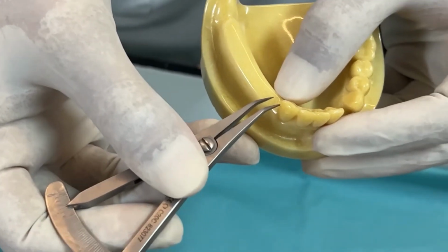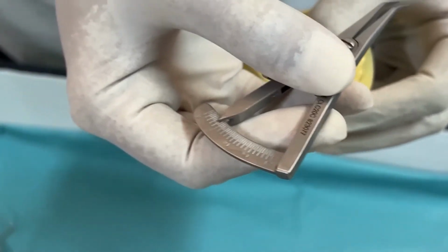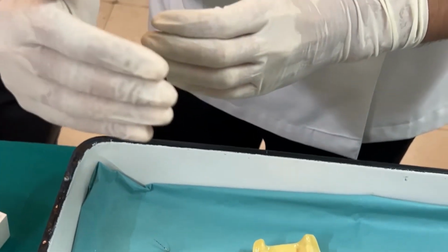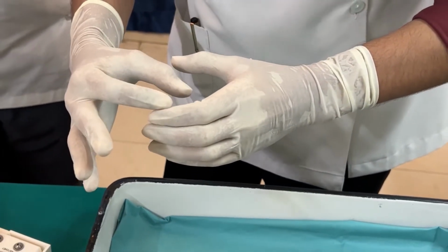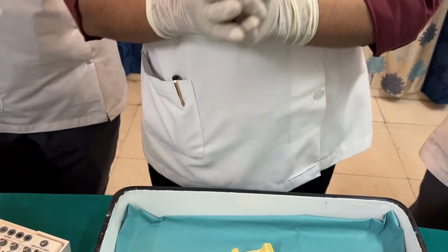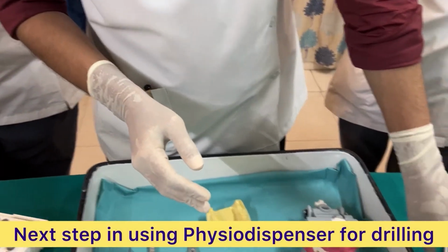So did you understand the concept? Why did I measure it as 4 millimeter? 2 millimeter from the outer border of the implant to the adjacent tooth, and 2 millimeter is the radius of the implant which we will be placing, right? So the next step is the Physiodispenser.